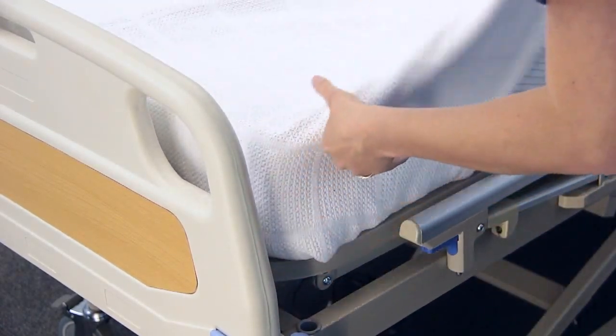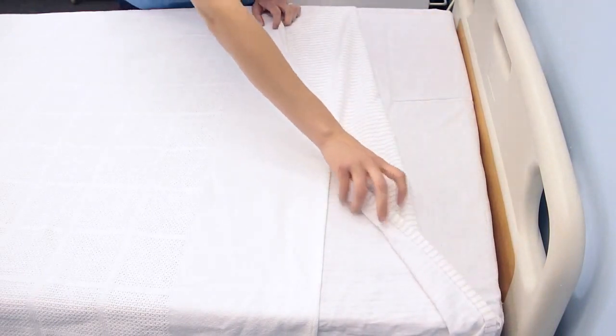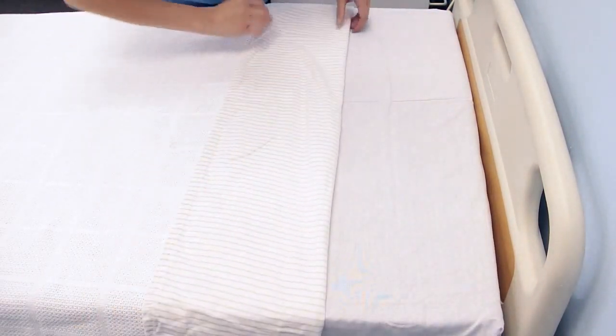Move to the other side and repeat the steps on folding and tucking the top linen. Note: if a duvet is used, you will not tuck it in but let it hang neatly over the edges of the bed. Fold the upper 30 centimeters of the top sheet over the bedspread in order to make a cuff.